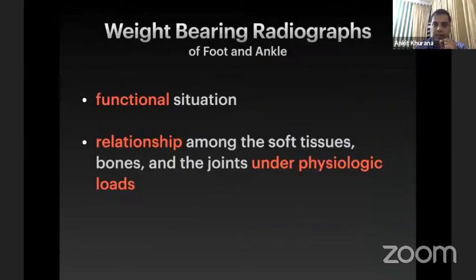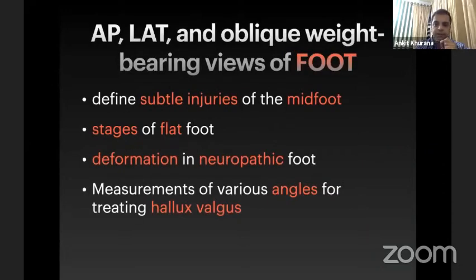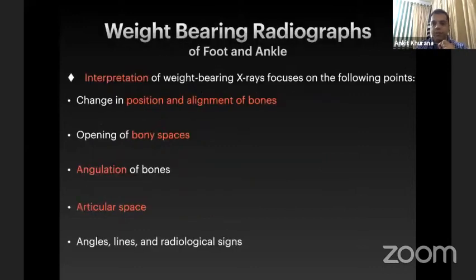Coming to weight-bearing radiographs, which are the most important part of radiological examination for any foot and ankle surgeon, because they tell the functional relationship of all structures under physiological loads. Weight-bearing radiographs of the ankle are indicated in flat foot, as well as to assess the integrity of the deltoid ligament. Similarly, weight-bearing radiographs of the foot are indicated to assess subtle injuries of the midfoot, to assess the stages of flat foot, to assess the deformation that takes place in neuropathic foot, as well as to assess various angles that are used for treating and evaluating hallux valgus of the foot.